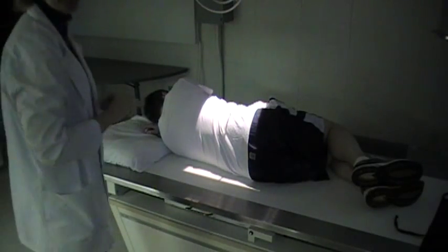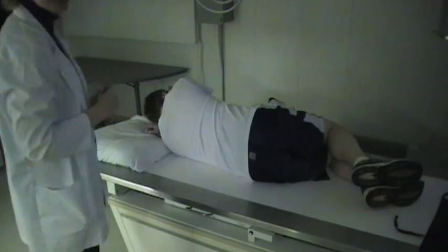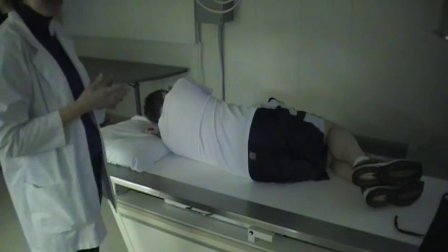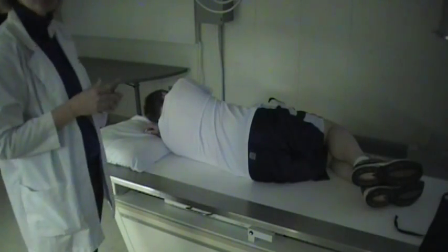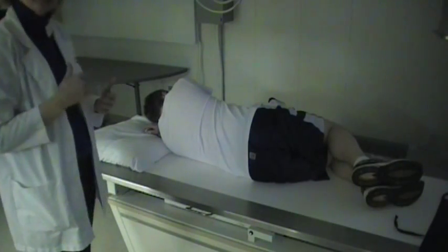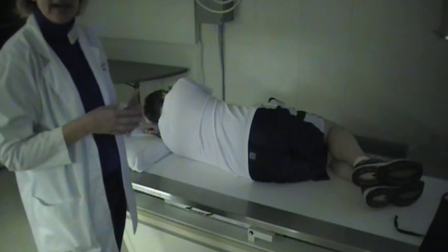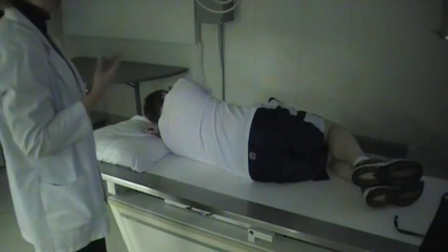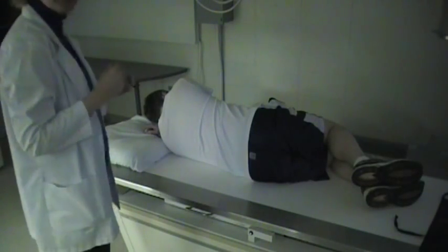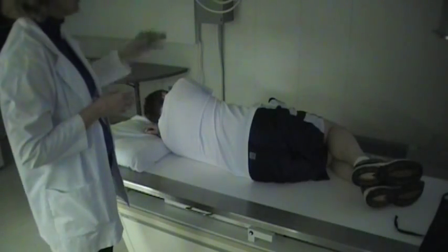We're going to be doing the hyperflexion and hyperextension of the lumbar spine. This is a functional study, and oftentimes you'll be doing these studies on patients after they've had back surgery, or sometimes after they've had time to heal following a trauma to the back. What the doctor wants to see with these bending images is the flexibility and the stability of the spine.